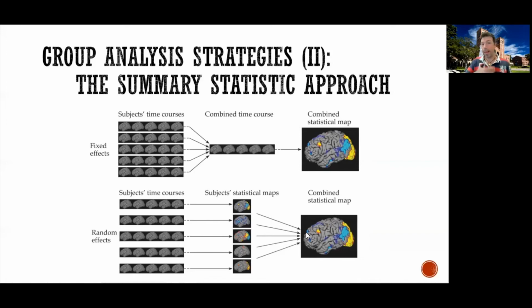All right, so in fMRI, in order to avoid doing the giant all-in-one model, which is the correct one, but it's just too inefficient to carry out, we resort to this so-called summary statistic approach, or it's often also known as the hierarchical approach.